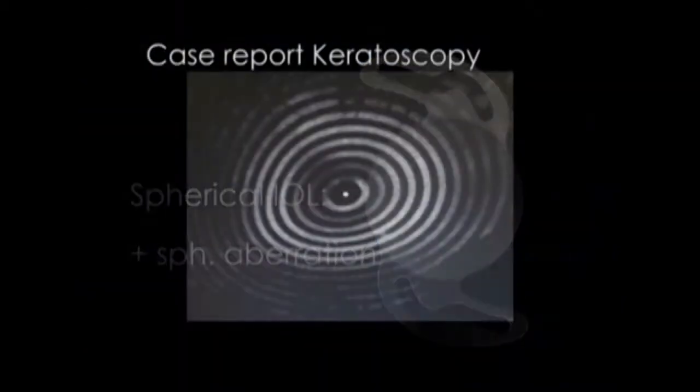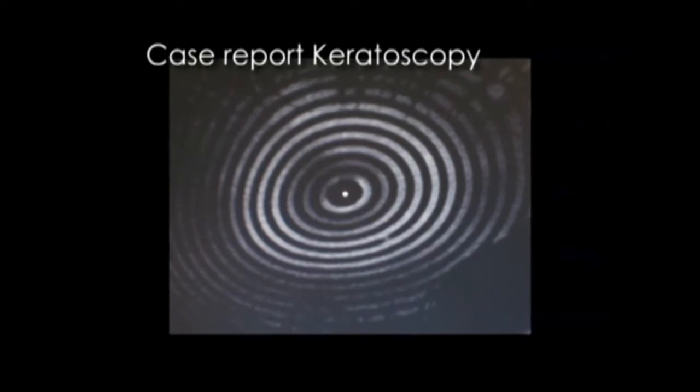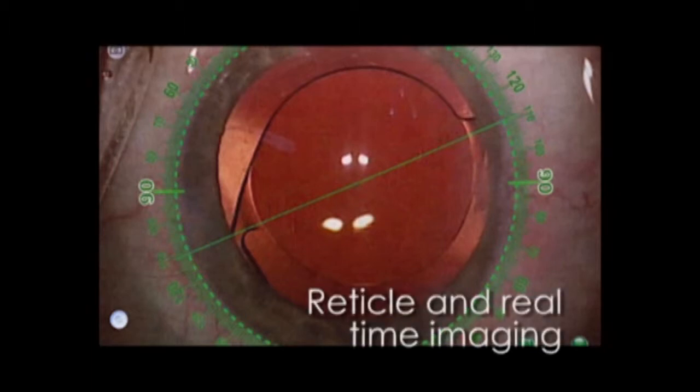The use of toric IOLs in patients with stable cone and reproducible astigmatism in all meridians, as in our case, where axis and amount of astigmatism are consistent on all the instruments, is becoming the gold standard. It is a hot topic on our society web forum.